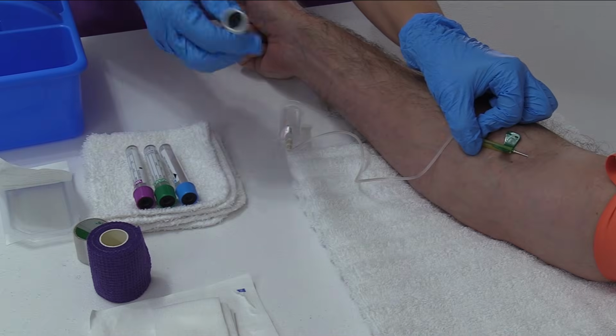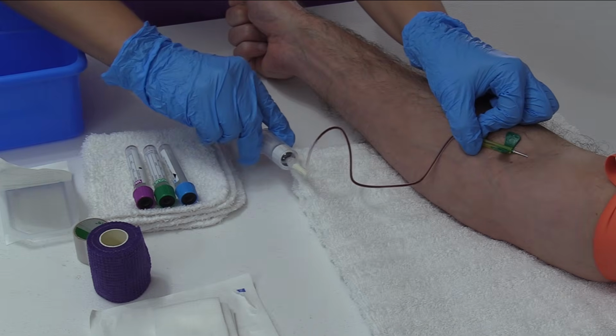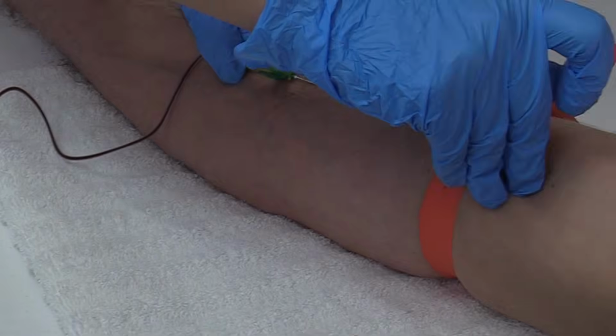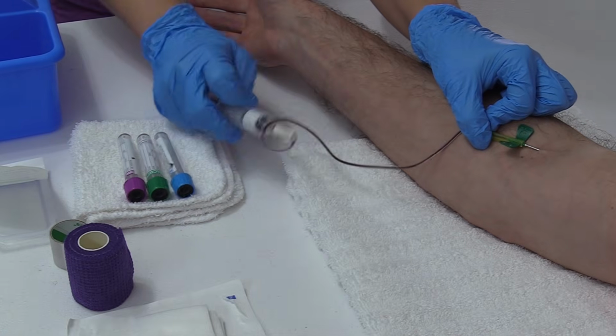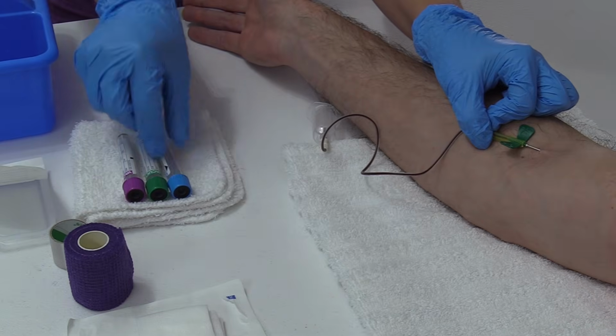First, I'm going to pop on my waste tube. Now I've established blood flow. So I'm going to quickly release your fist and pop this tourniquet off. I'm going to let this fill about 3 to 5 milliliters. That's good. That's my waste. I'm going to just set that aside.